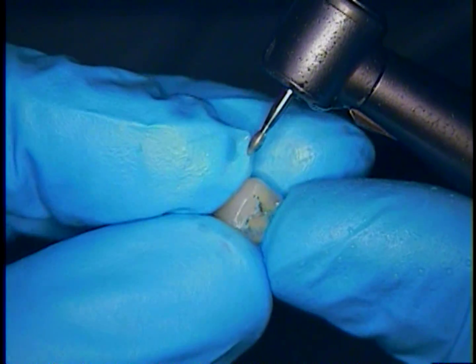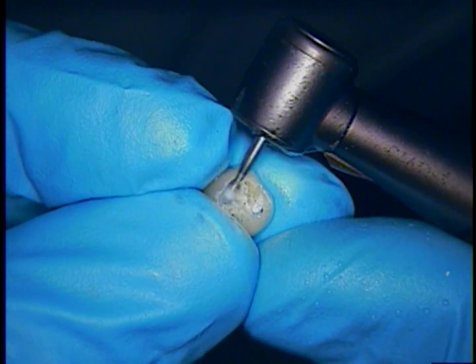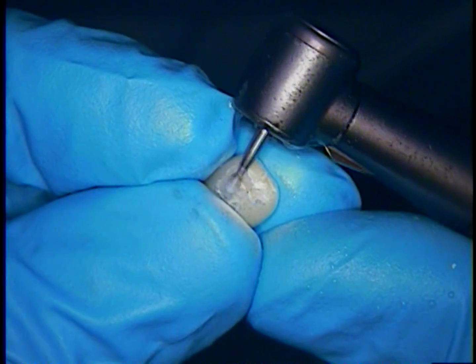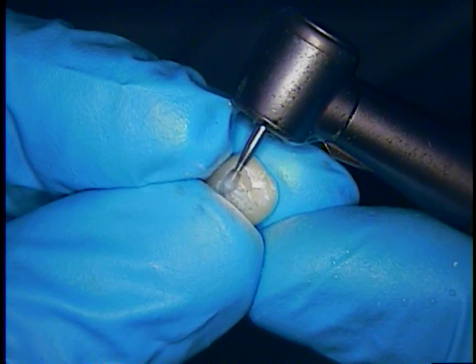If you go in there with a coarse diamond, you are going to invite microfractures in the porcelain, and then you would have problems down the road. So very, very light adjusting here. I always say we are just dusting your bite — just dusting the occlusion. That is all it is.